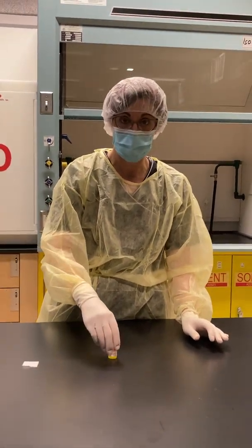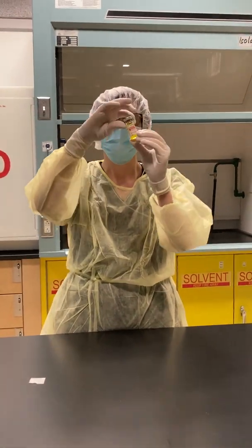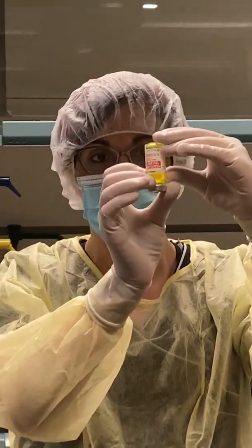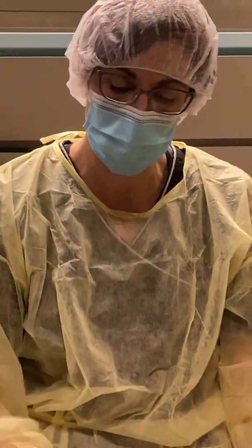I'm going to check to make sure that all the drug is dissolved by flipping the vial up. This way I can look to see if there's anything floating — any coring or undissolved drug — in which case it would just need to be shaken a little bit more.